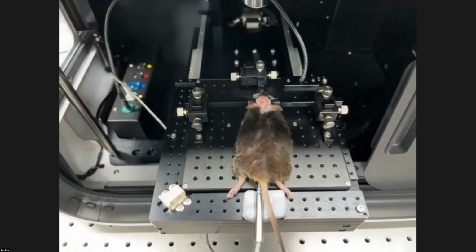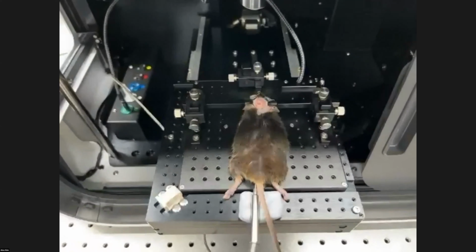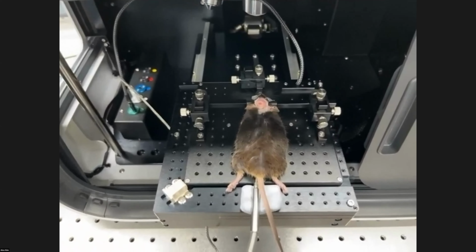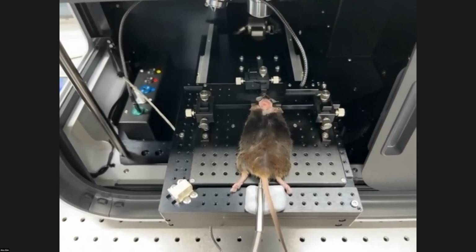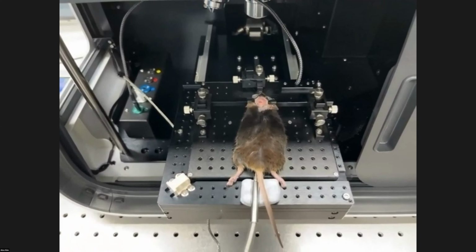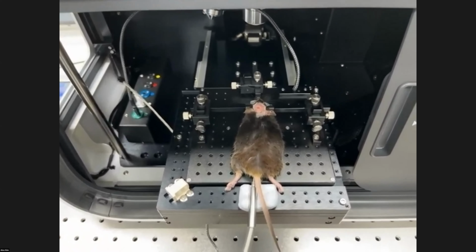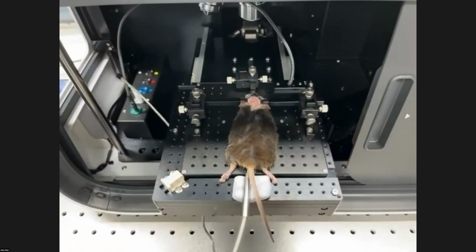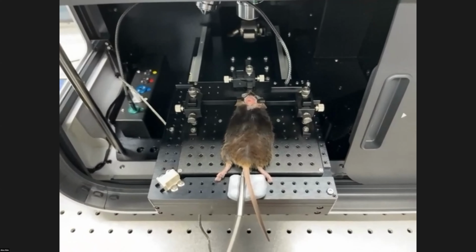With the cranial imaging window implanted mouse mounted on the stereotactic plate with heating functions, we can observe the brain from the meninges to the cortex, with imaging depths of 100 to 150 micrometers in the case of confocal, and 200 to 300 micrometers in the case of two-photon microscope.